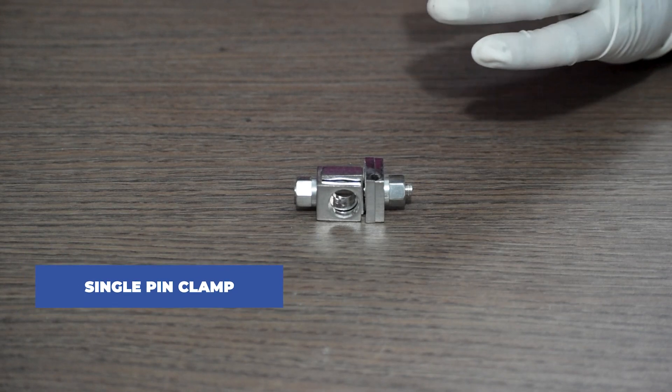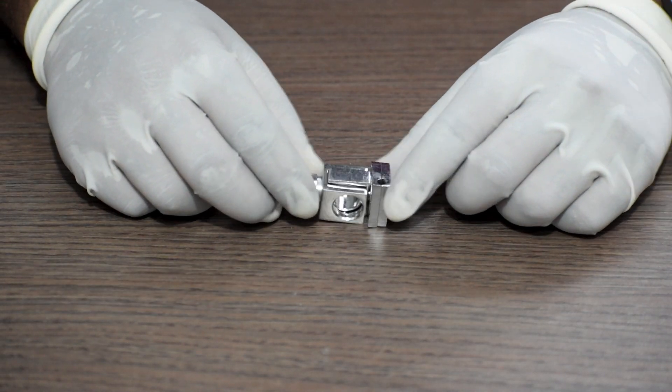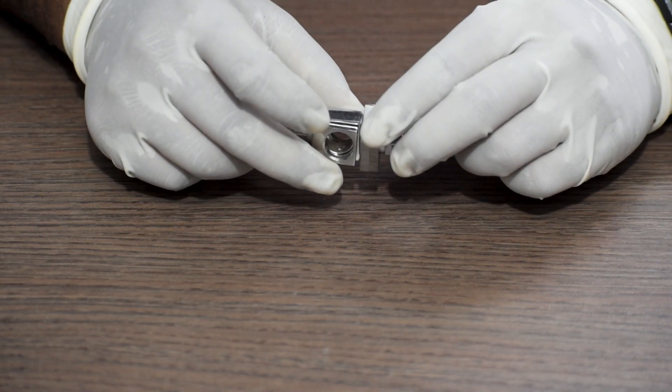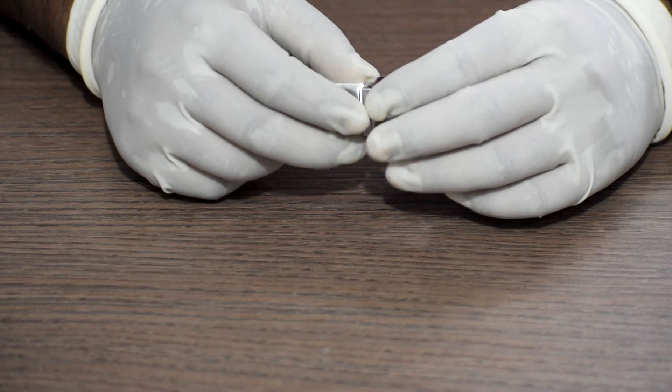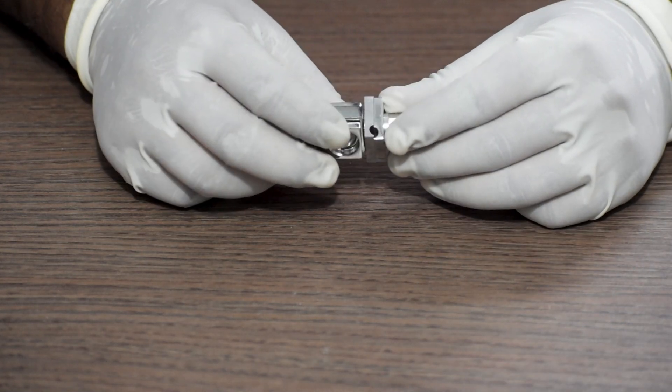Next we require a single pin clamp. As you can see, there is a hole for the pin. You can use this for 3.5mm, 4.5mm, or 6.5mm pins.